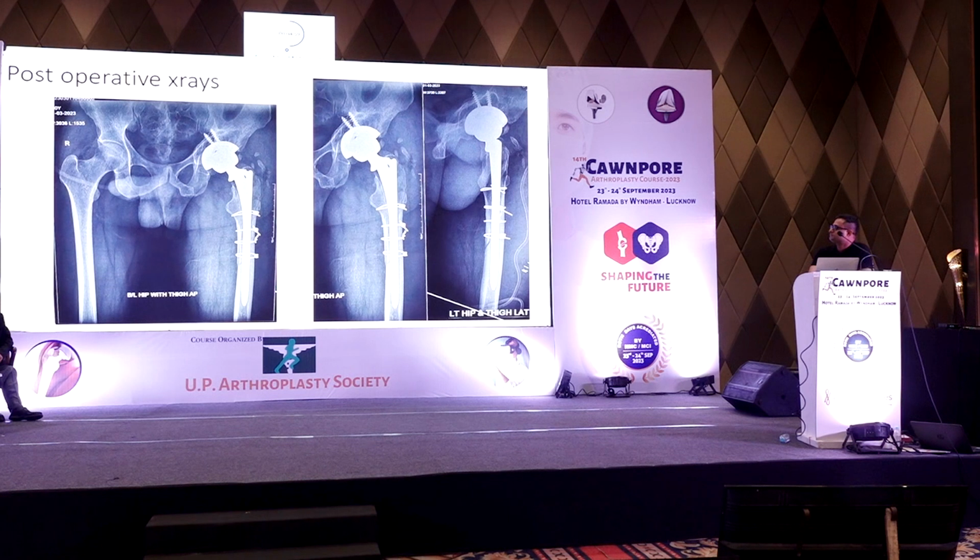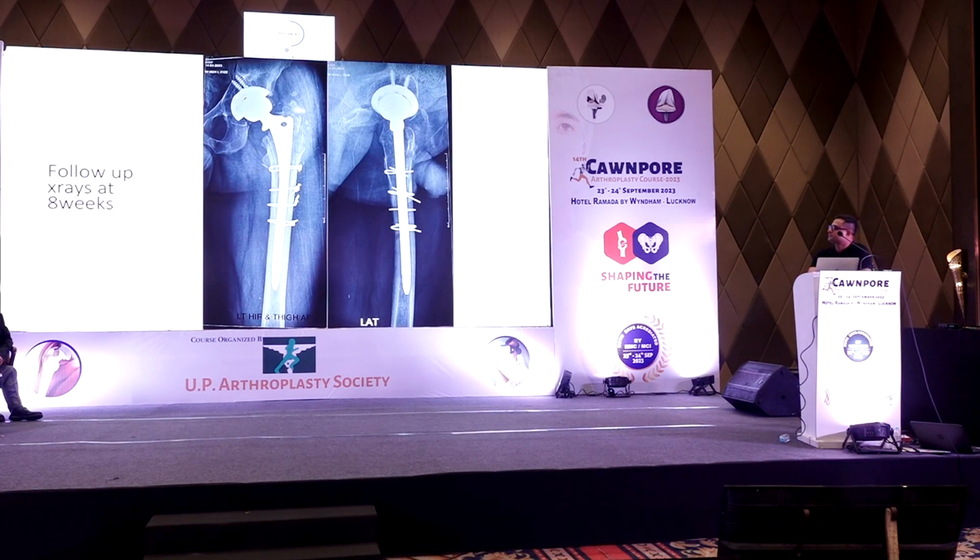So you've done that. This is post-op. Yes, sir. No, we are talking about the follow-up. Both hip X-ray is not there. Follow-up, it's always advisable to take both hips, because you will not know otherwise whether there is length change or subsidence and all those things. You have to compare.